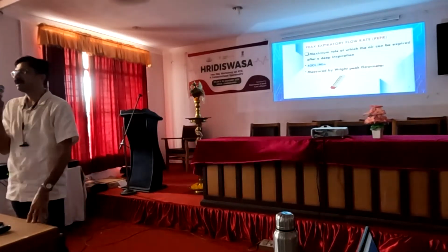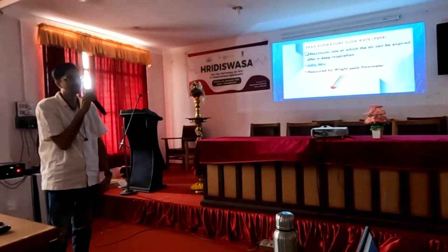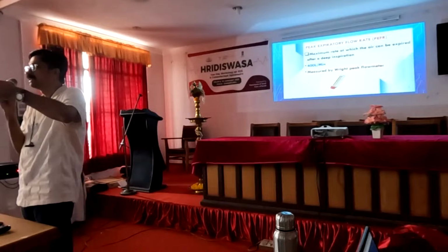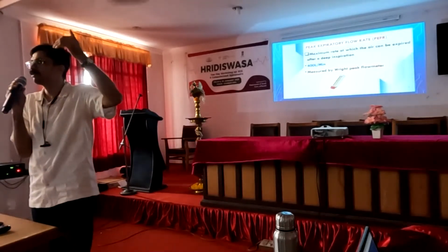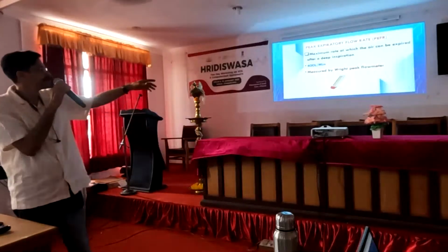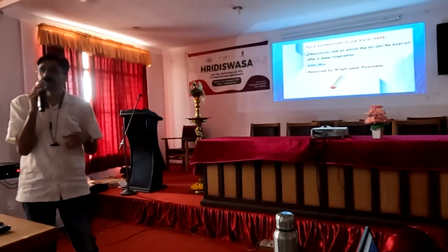Next, the peak expiratory flow rate. During expiration, at one point the airflow rate will be at its maximum. We analyze it using a peak flow meter.